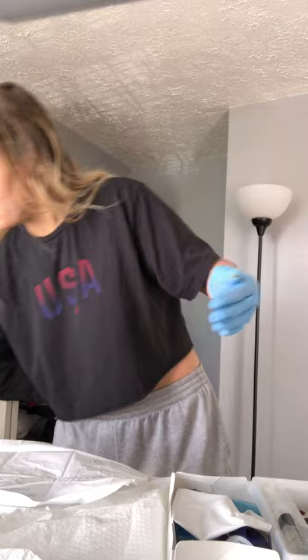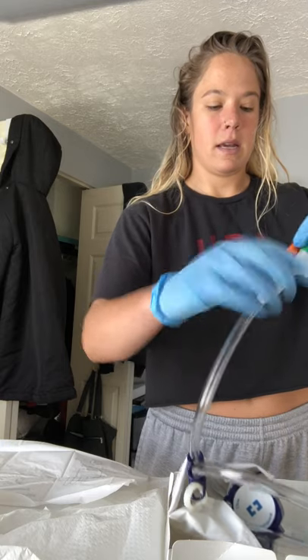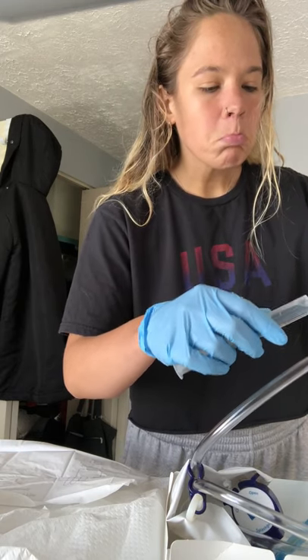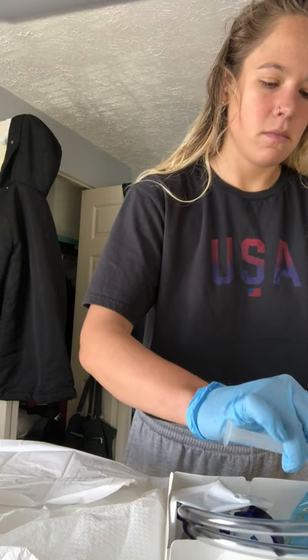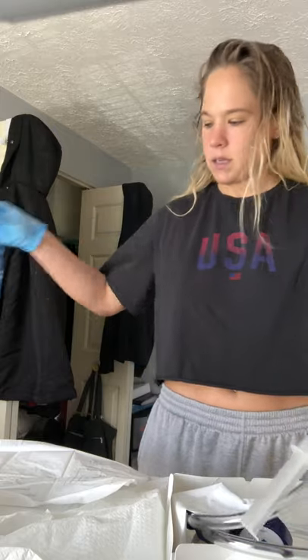I'm going to put the iodine solution container into the trash. At that time, I'm going to go ahead and connect the saline. I'm going to go ahead and remove the plastic wrap and put that in the trash as well.